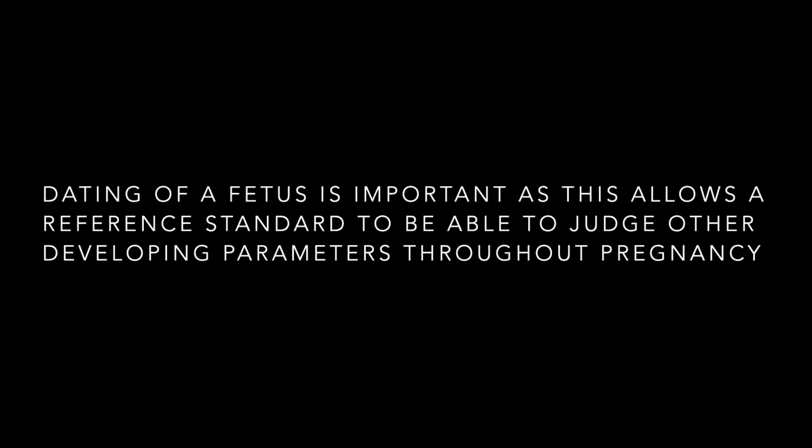So it comes down to the point that dating a fetus is really important because it allows us to have a reference standard by which we can judge other parameters that happen throughout pregnancy. So, we can judge how far along the baby is, right? When we're expecting to have some delivery, what threshold we need to reach before it's safe to deliver. And then as the baby's growing and developing, is it growing in all the different spheres of its growth, right? The different organ systems, stuff like that, according to expected parameters relative to its predicted gestational age, right?